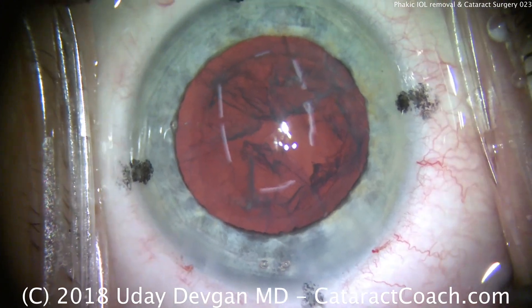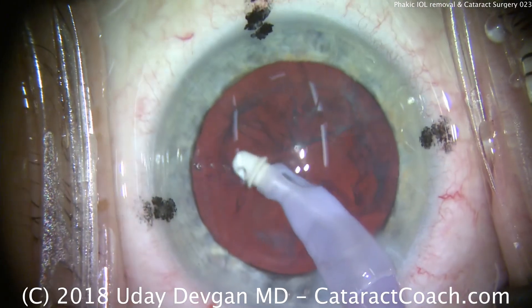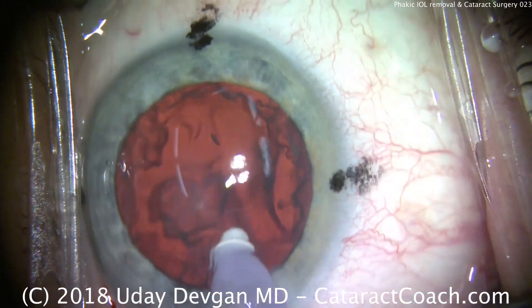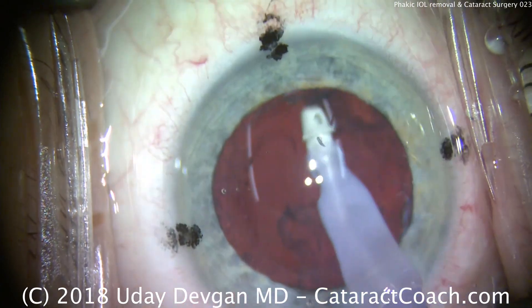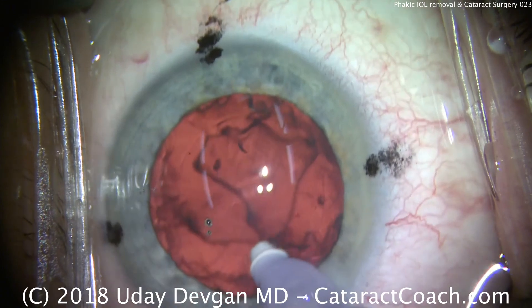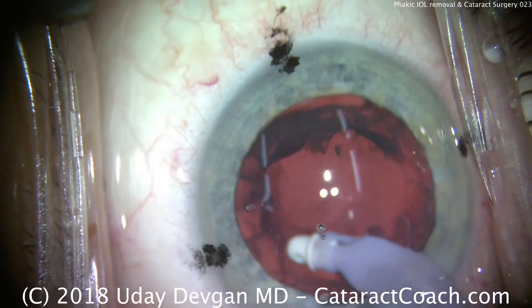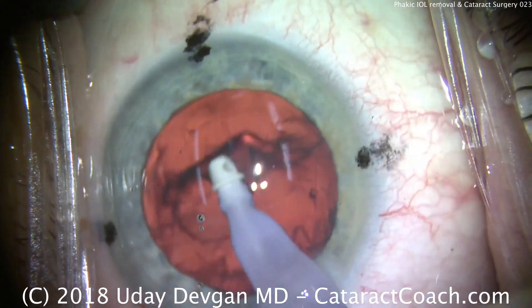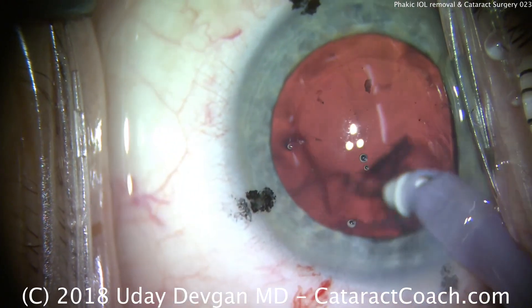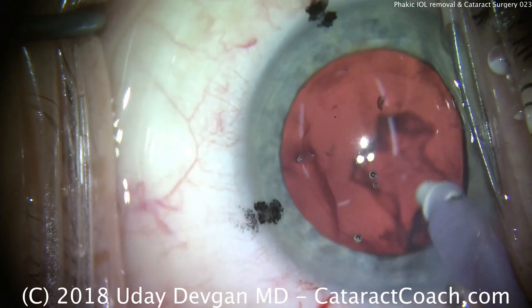In a case like this — a high myope — we don't want to take any chances; we can't risk breaking the posterior capsule. Here's the IA probe going in the eye; we'll remove all this cortex and clean up that capsular bag nicely. The advantage of a phakic IOL for a younger patient is it allows retention of accommodation. In a presbyopic patient, certainly over the age of 60, I think the patient is probably better served with a clear lens extraction and refractive lens exchange. High myopes have a risk of retinal detachment with cataract surgery, so this patient had his retinas checked in detail by our vitreoretinal colleague before surgery, and we'll also have him seen in the post-op period.